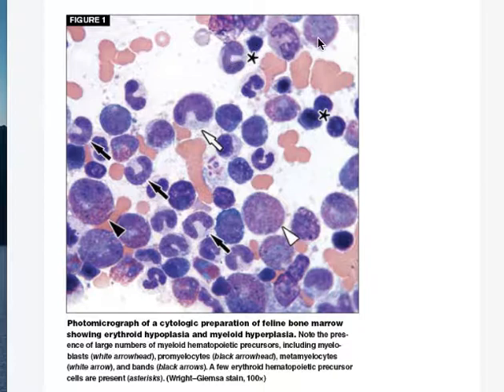So myeloid, myeloid, myeloid, myeloid seg, right? Probably myeloid, can't read it very well. Erythroid, erythroid, erythroid. Probable erythroid, erythroid, myeloid, myeloid, myeloid, maybe erythroid. It's probably an early eosinophil, so myeloid, myeloid, myeloid, myeloid.